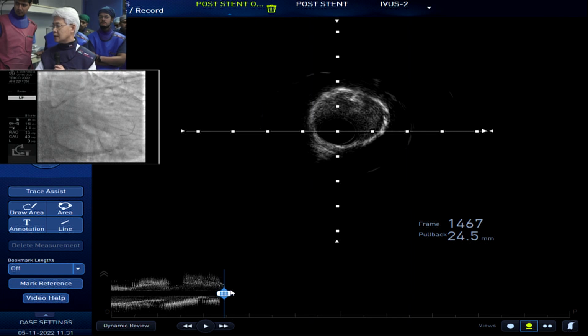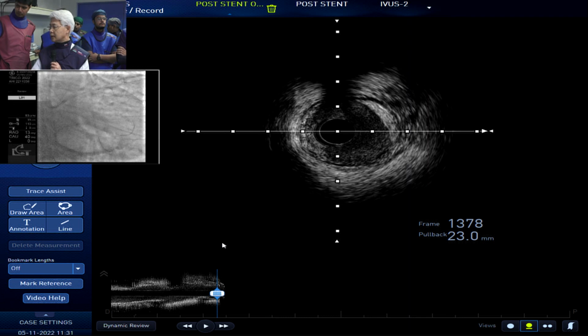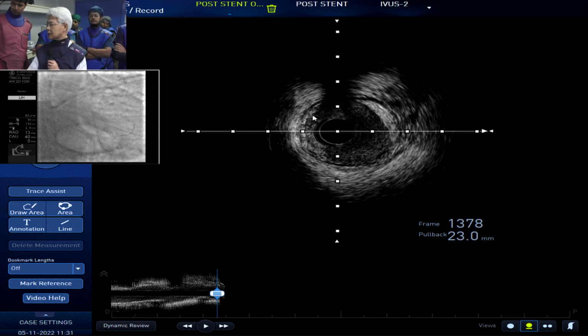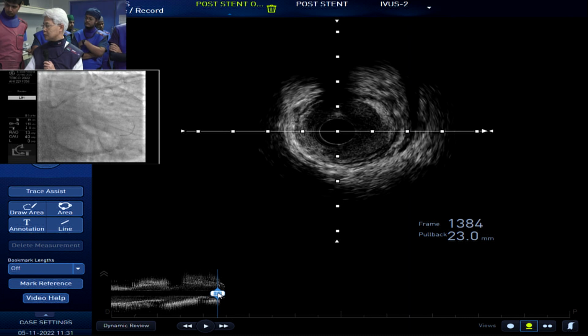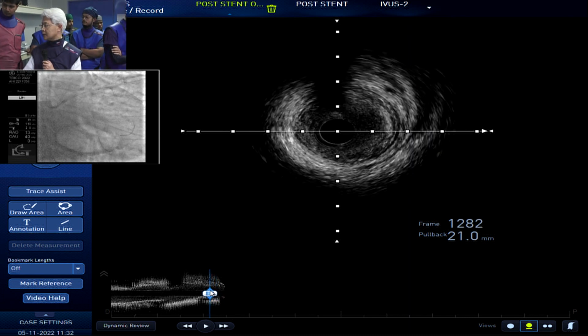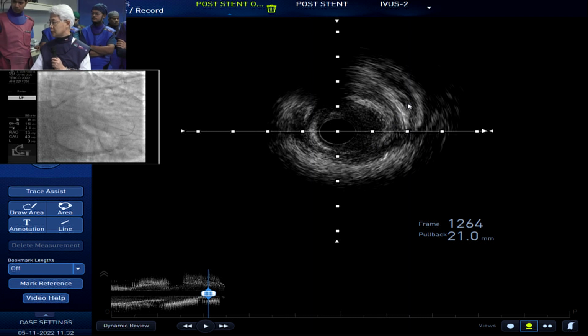Yes. Or into the lumen of the artery? When you say entry, it's at the start of the side branch. You can identify the media here, right? Yep. So it might be okay. And try to move to the distal site, right here. I'm afraid of some huge intramural hematoma, but still the intima is okay, and we can identify the media here, right?